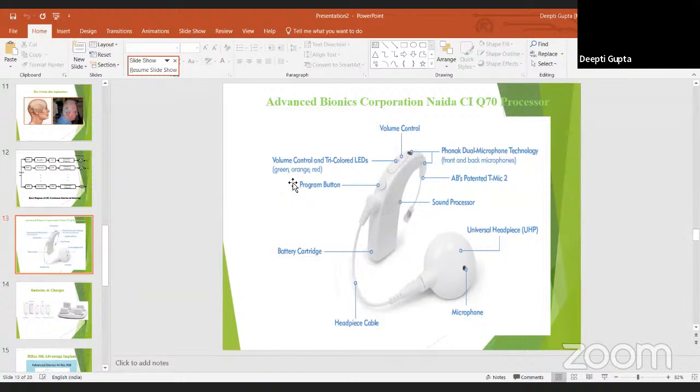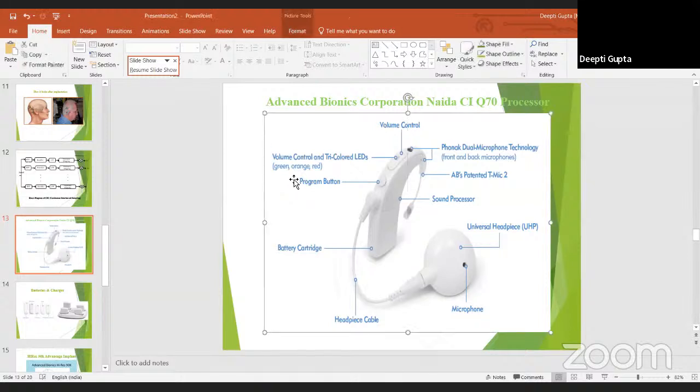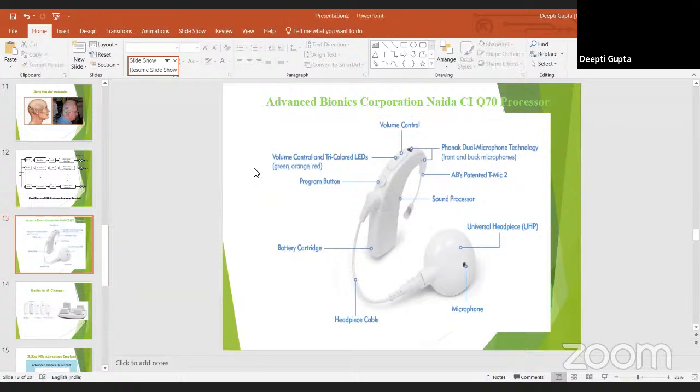This is a requirement for the user, that the user should know in advance what the meaning of that is, so that he or she is able to operate the cochlear implant properly. Or if the CI user is a child, then the family person should know about it.